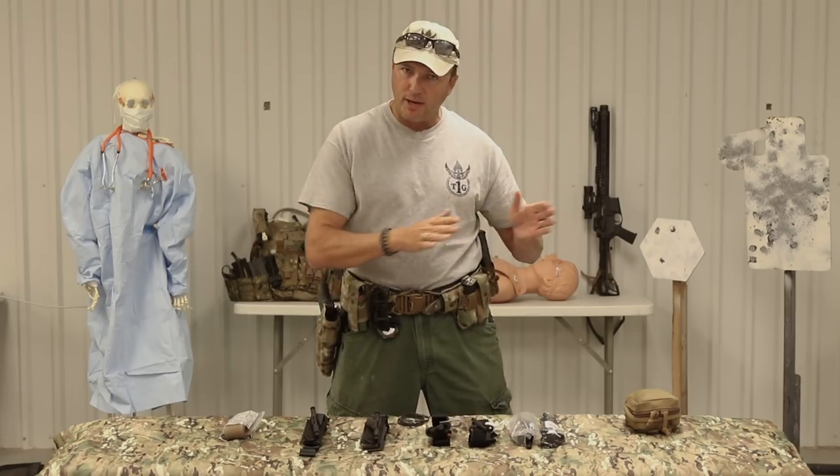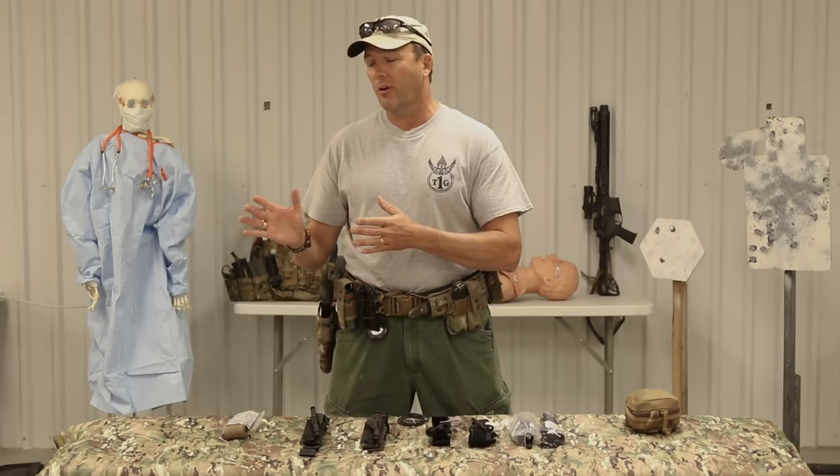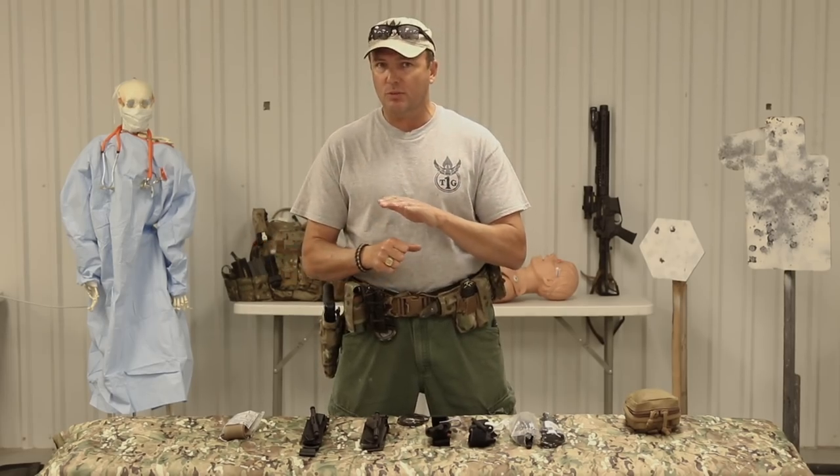So long as it's been approved by them, it's a squared away tourniquet. Out of all those hundreds of brands out there, we here at Tier 1 Group's medical program prefer to push two particular types: the CAT-T and the SOF-T Wide. And on both of those, there's a new generation, and those are the ones that we prefer.